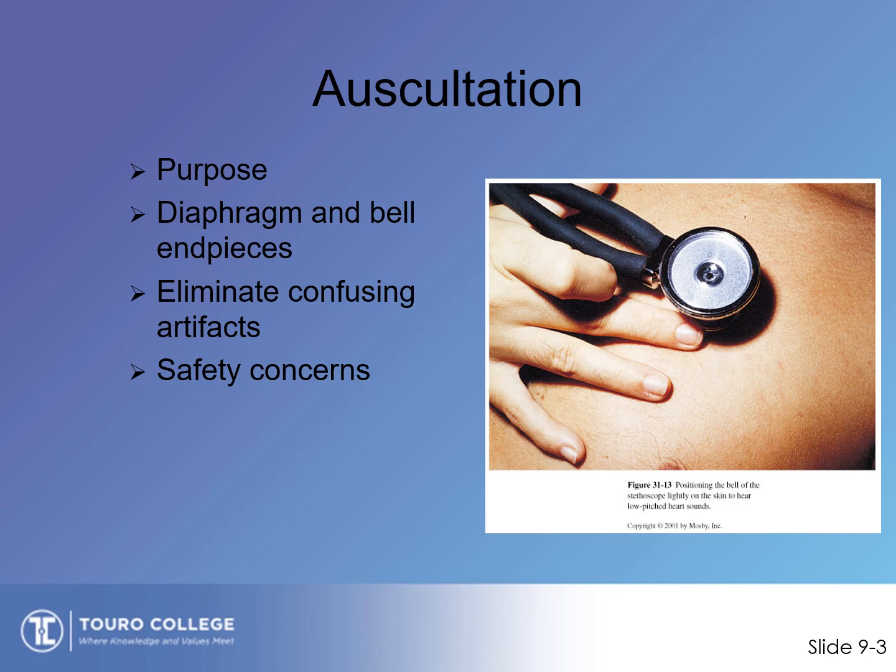I wouldn't waste my money on an electronic stethoscope. I only have one because my workplace pays for it, and it seems so cool, but it doesn't really work well on lung sounds. Heart's okay. I much prefer the Littmann, but invest in a really good stethoscope.